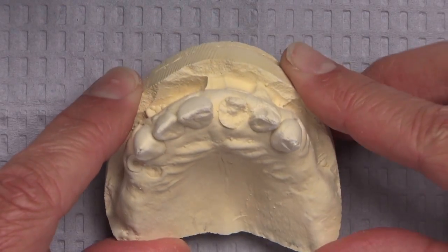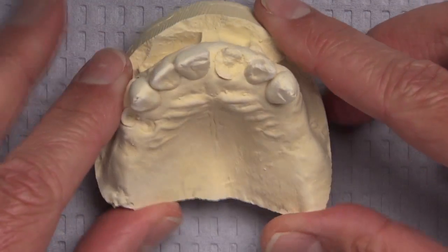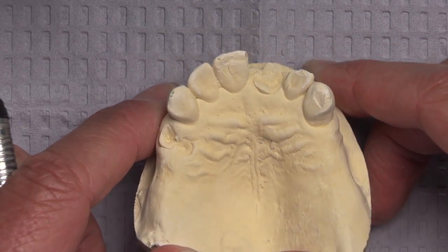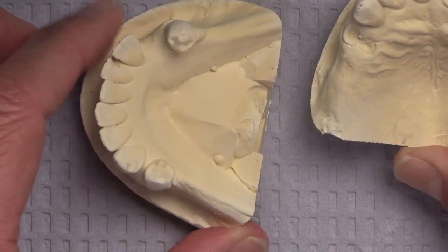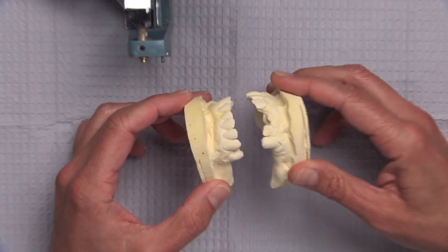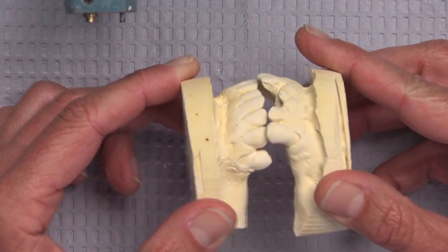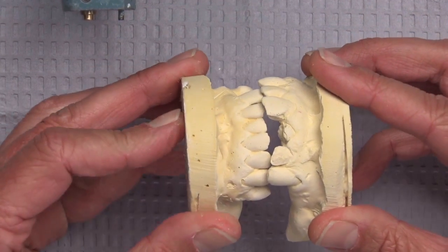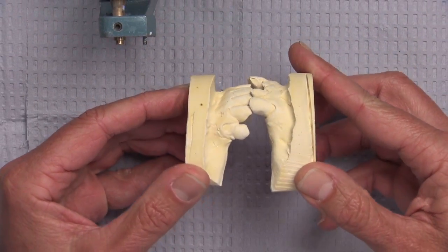Here's a pretty typical bio temps case. You can see we've got two teeth that are broken off nearly at the gum line — the central incisor and the first bicuspid — and the doctor wants to prep all these teeth and replace those two that are broken down. Looking at the opposing model, the patient really doesn't have much in the way of posterior teeth, and when we put these two together there's really nothing in the posterior to help us get this relationship. The doctor took a bite registration but it was just on the anterior teeth, so when we went to mount it we still had a difficult time figuring out where these ridges would be in relation to each other.